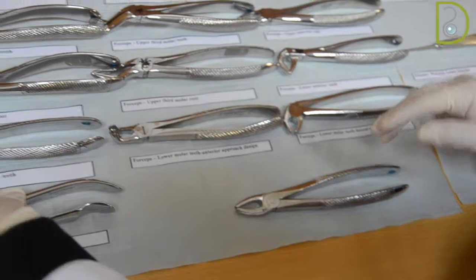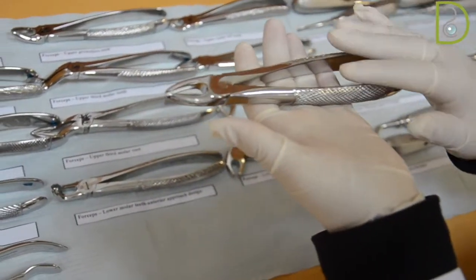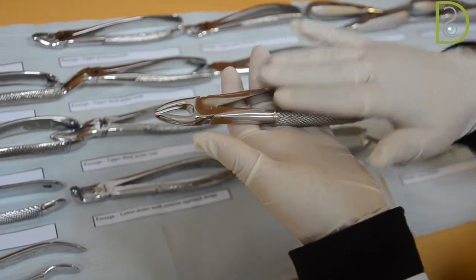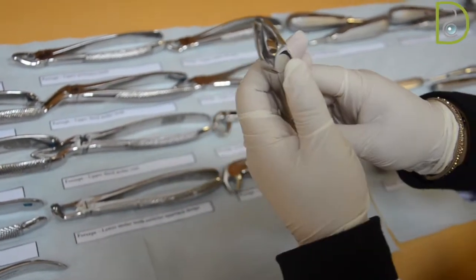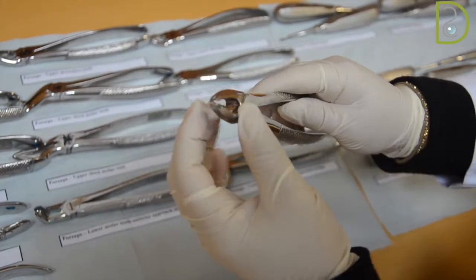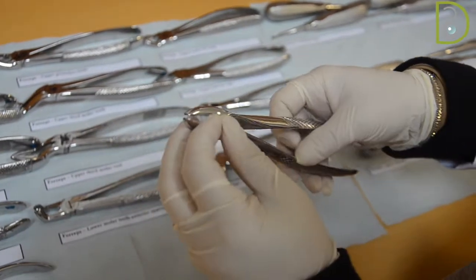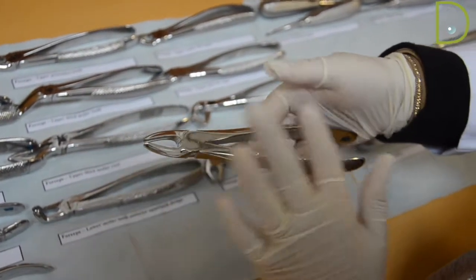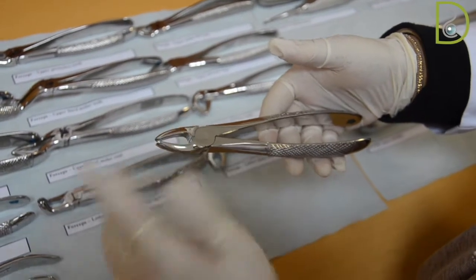Now we will start demonstrating all different kinds of upper forceps. For the upper anterior teeth, you will find that the beaks are a little bit broad, they are open, and they are exactly parallel to the long handle. So there is no curvature of the beaks.